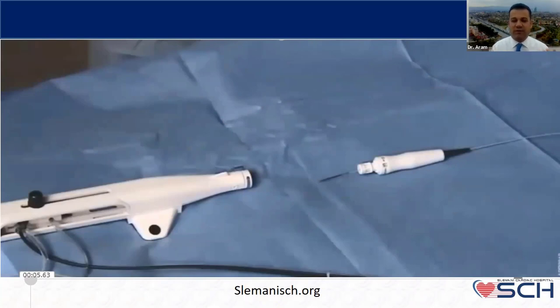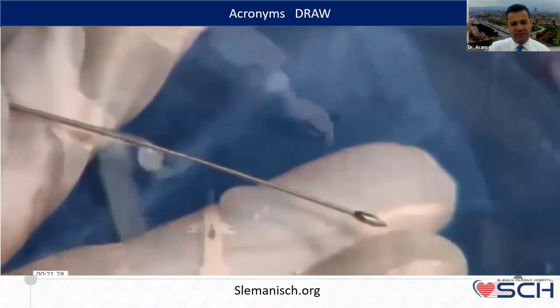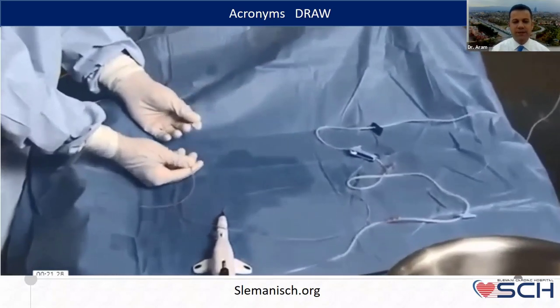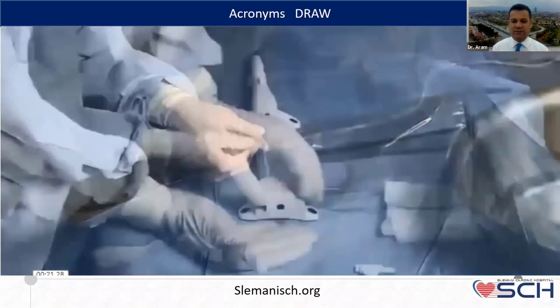So imagine the amount of heat that will be produced by this device. That's why we continuously need a saline infusion. That's why we are going to inflate the bag with a sphygmomanometer cuff. There are dedicated cuffs for that, up to 200 millimeters of mercury, just to keep the saline under pressure. So till here we are good. The saline infusion is coming from the bottle. It should be on during the whole procedure, because this is the cooling system of the device.